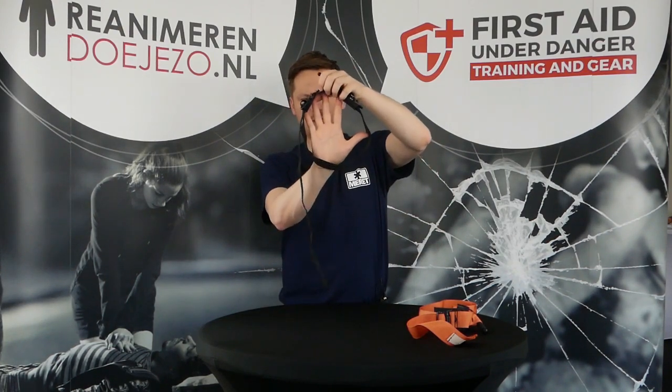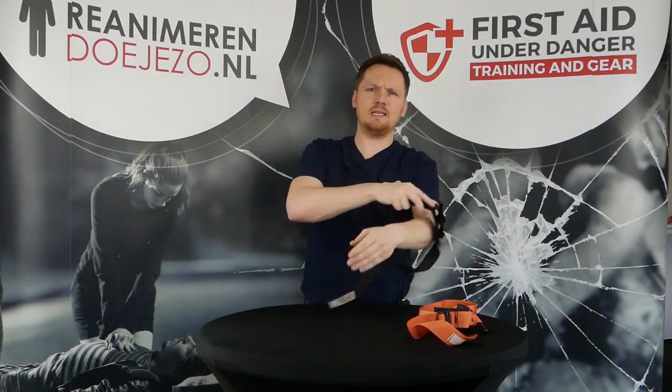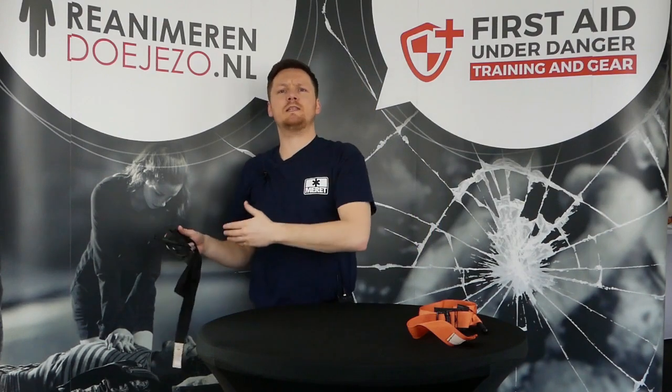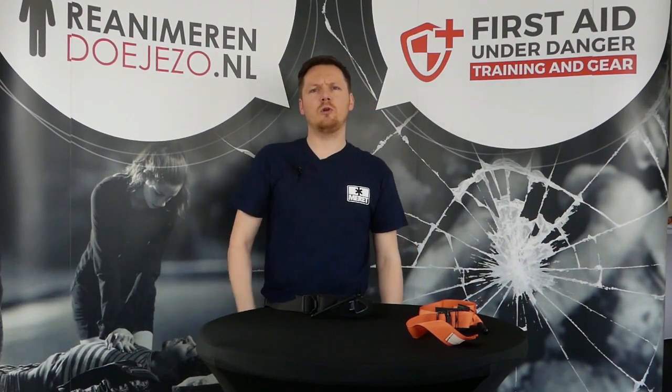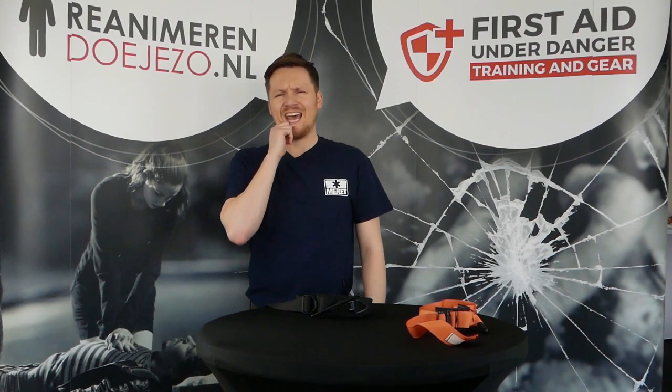Like this probably. You see, this is about the width of my hand. I can place it in here, so that means that I can place it easily around an arm, but also place it easily around your leg. I'm gonna keep my arm like this, because if your arm is injured, you will not be very pleased moving it around a lot. And that is what I see.